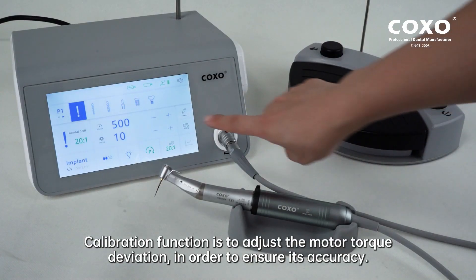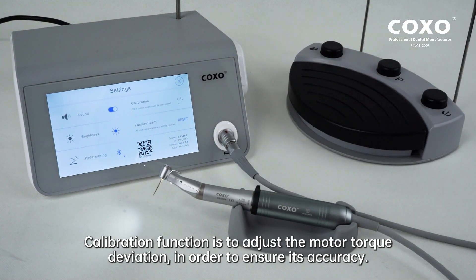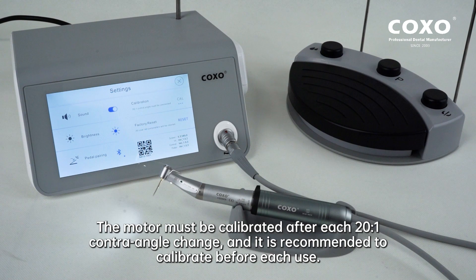The calibration function is to adjust the motor torque deviation in order to ensure its accuracy. The motor must be calibrated after each 20:1 contra-angle change, and it is recommended to calibrate before each use.